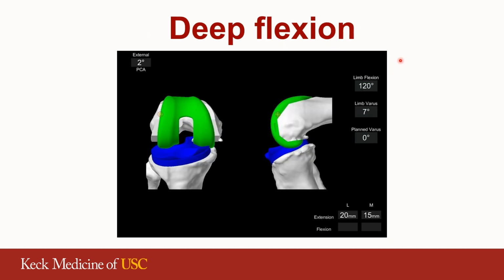Characterize the range of motion: in flexion, this patient with this degree of deformity can flex to a maximum of 120 degrees prior to any releases or osteophyte removal.